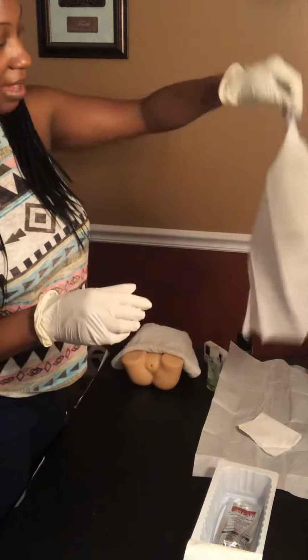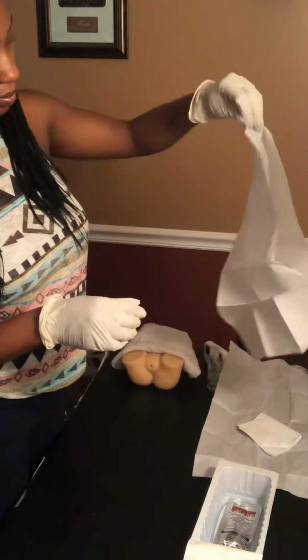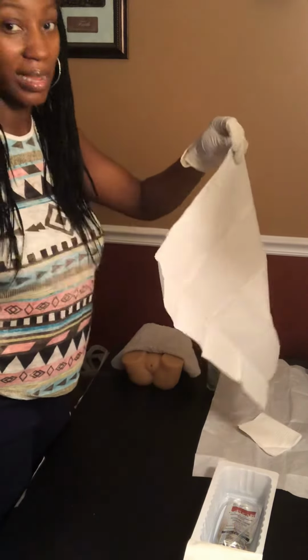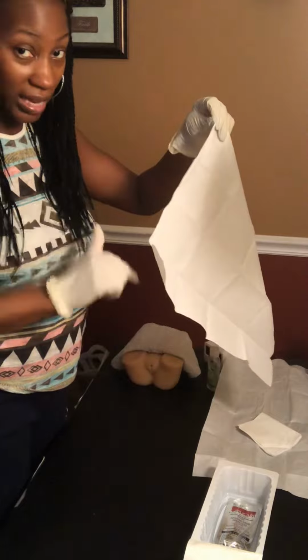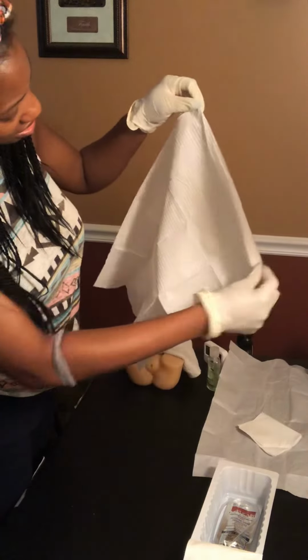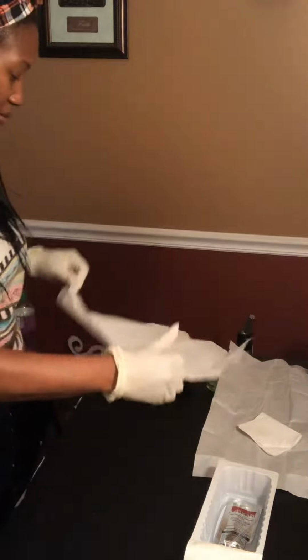So sunny side down, and a way to remember how to lay the drape is just remember the sun shines down. Sun in the sky, it shines down. So shiny side is down. So let me find the shiny side. Guess it would be this one.